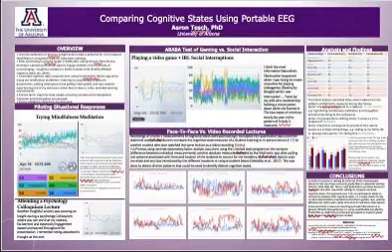And throughout the lecture, you can see that there were parts of it that seemed to spike the engagement measure, especially when I was thinking about questions that I might ask the presenter. Other Emotiv measures also spiked at the same time. So you can see that their measures of focus can correlate with the measurement of engagement.